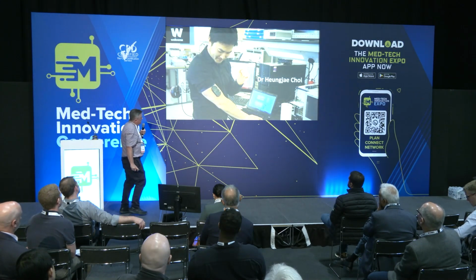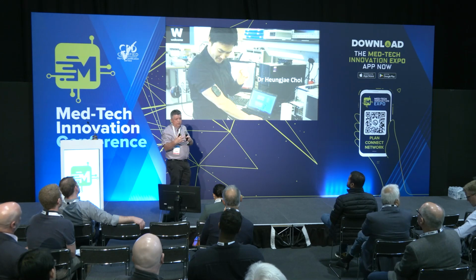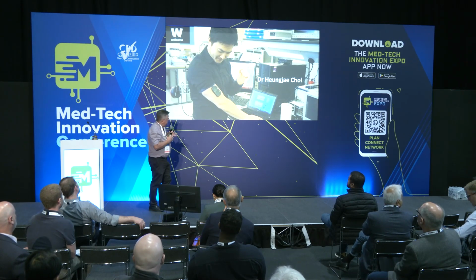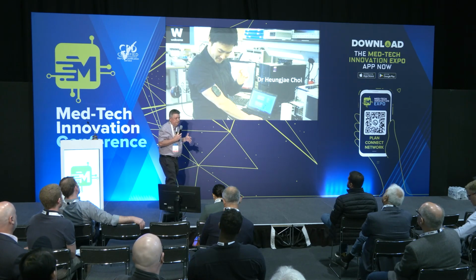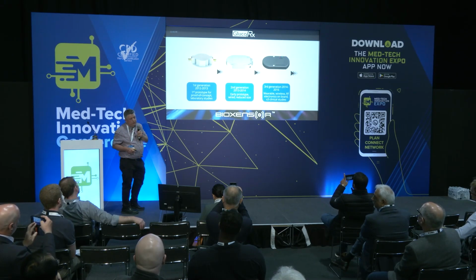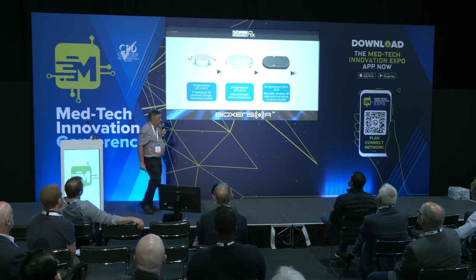the Translation Award. So it's basically taking on board all that onboard electronics on the box and putting them onto this wearable device. So it's got a rechargeable battery in there, and you notice it's communicating with not a mobile phone, but with a laptop computer. But it's fairly simple in terms of the system to imagine that working on an app. Okay, which of course is where we're going with the next generation device. So these are the 3 generations that we took through with the Wellcome funding.